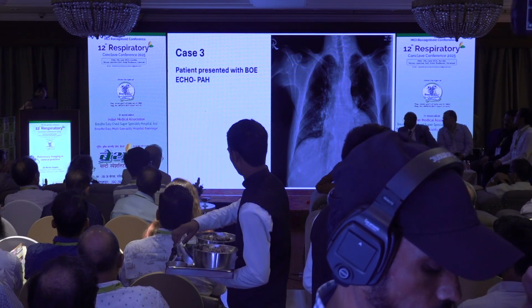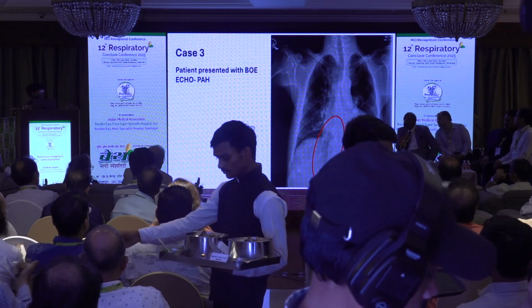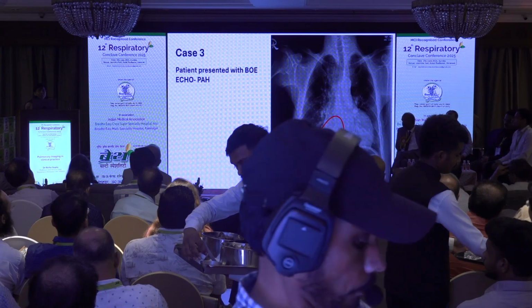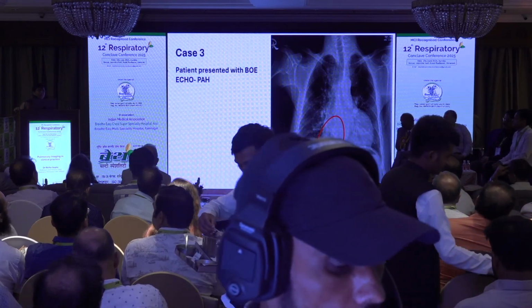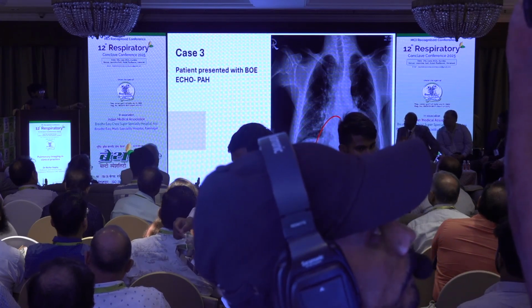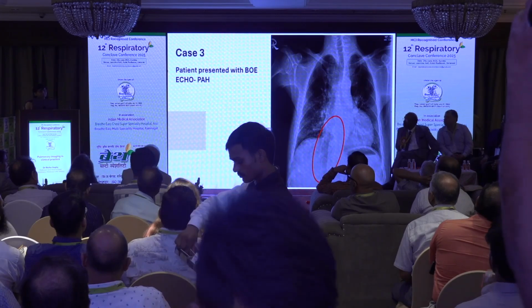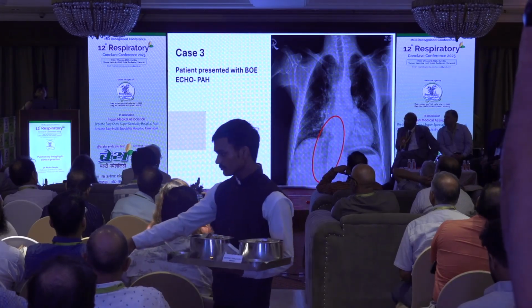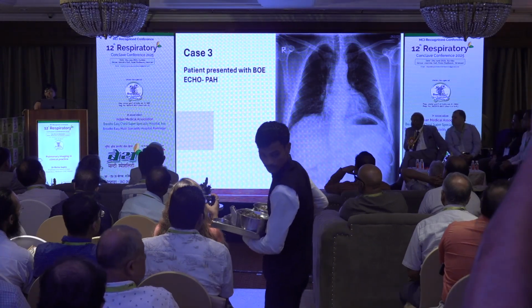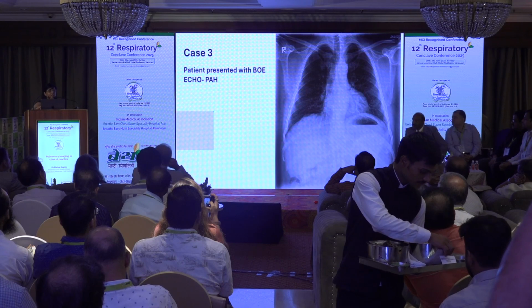Okay, so I don't know if you're not able to see, but in the interest of time, I would say, look at this foreign body which is there. So I asked the patient, did you have any procedure done at any time? So he said that some in 2012, this is a 2025 X-ray, in 2012 he was very sick, he had some catheter insertion done. So this is the 2012 X-ray, and you can make out that catheter. So this was an IVC, central line guide wire was retained while inserting IVC in the patient.